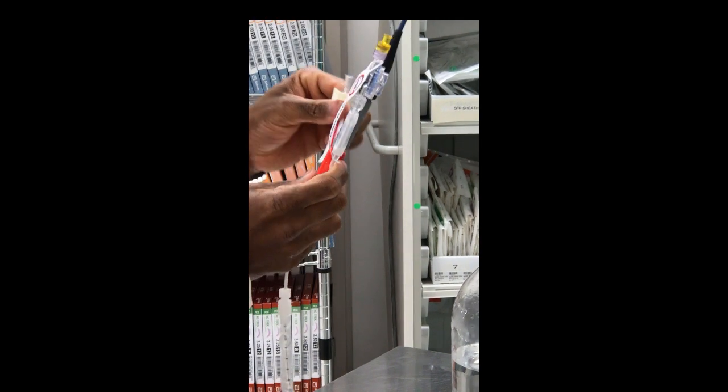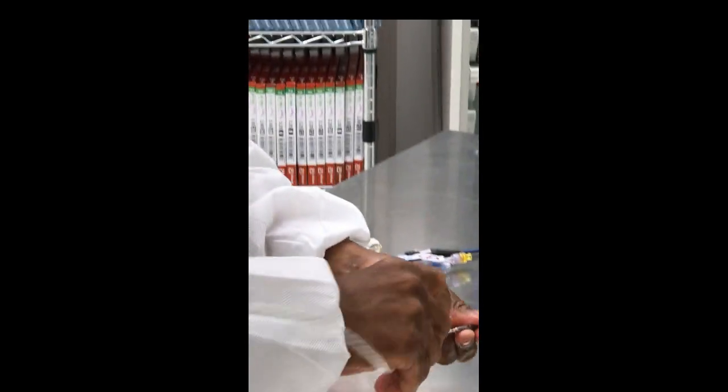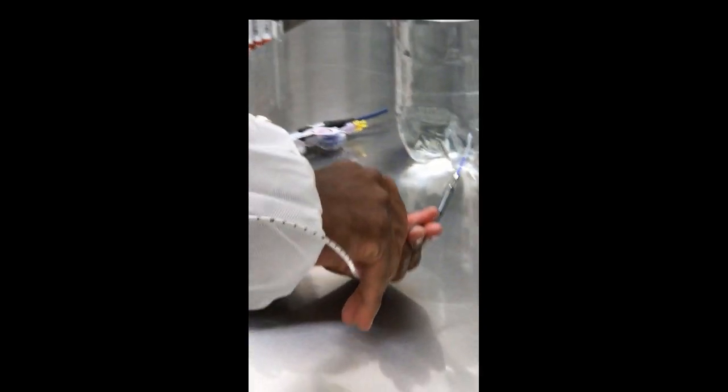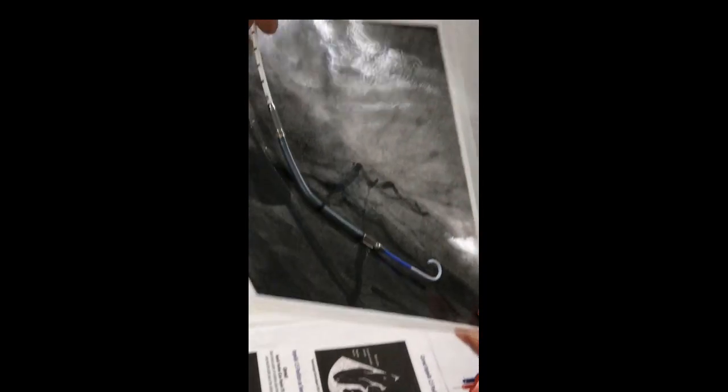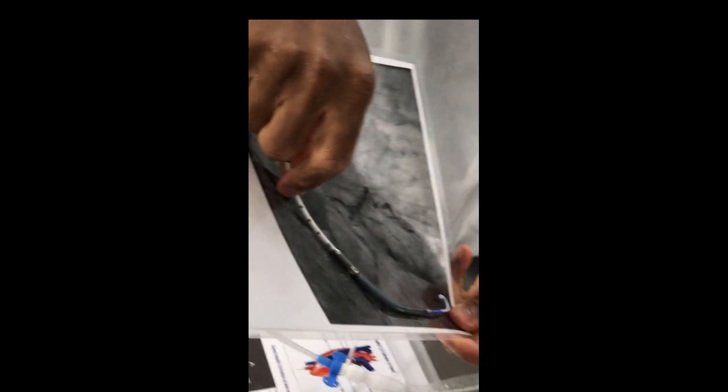The second P is Placement — where am I? This is like an A-line that communicates with a little hole drilled right behind the motor. If that hole is sitting above the valve, it will transduce an aortic waveform because it's sitting in the aorta. If it crosses the valve, it will show an LV waveform.